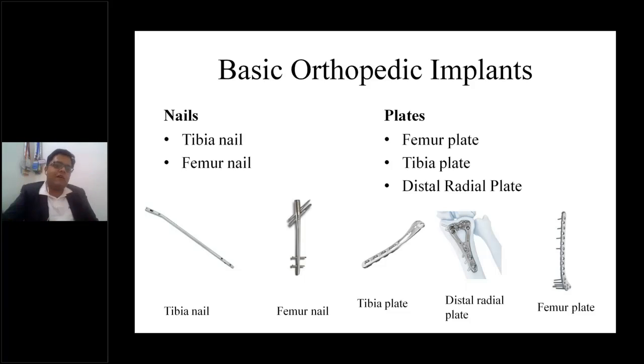For example, you have a locally Gujarat made implant which you are putting in a patient, and then that patient migrates to US, and the patient has a broken femur nail, and you don't have proper instruments because it is not validated, and any issues in removing of the screw has not been reported, then what the patient results in is a surgical failure because the doctor does not have proper instruments to remove that implant.